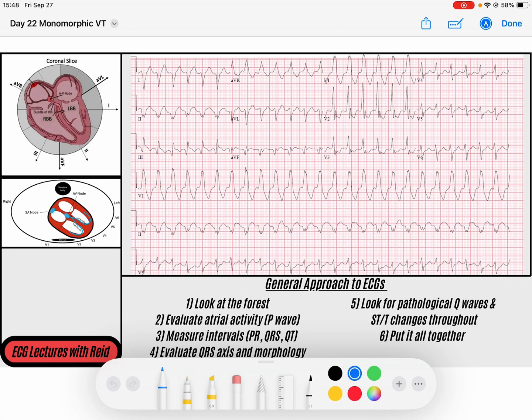Welcome back to day number 22 of our 30-day EKG challenge. Today we have a fun EKG — it's monomorphic VTAC round 2, and we're going to go over a few reasons why this is VTAC and not a different rhythm. I hope this really helps you solidify your understanding of VTAC versus SVT with aberrancy.